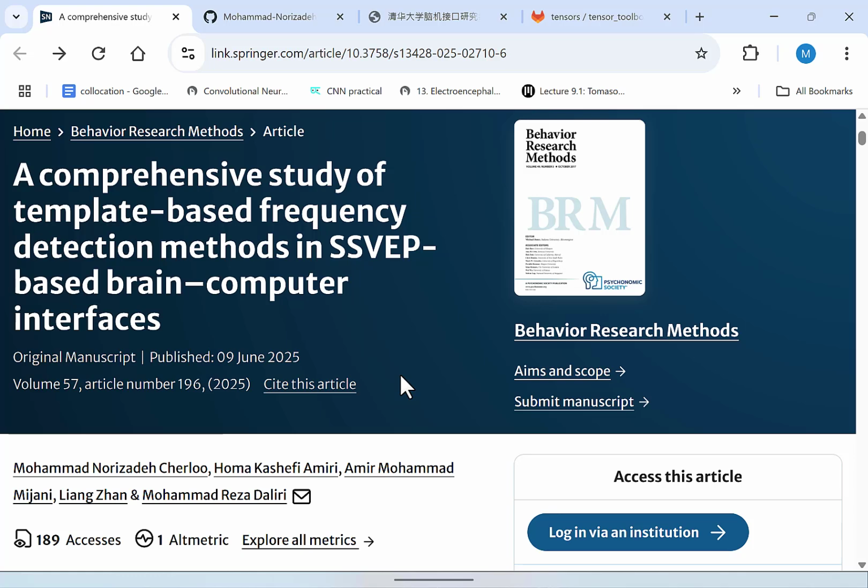for your own dataset. In this paper, we wanted to evaluate all methods under the same condition to see which method is good or which is not good. To be brief, we wanted to understand their pros and cons, and we conducted several experiments, and I highly recommend you to study this paper, especially the experiment 1, because we revealed 4 factors that are crucial to create an optimized SSVEP frequency recognition BCI.